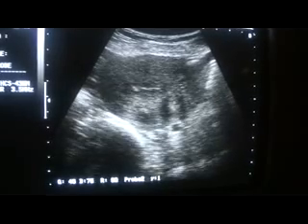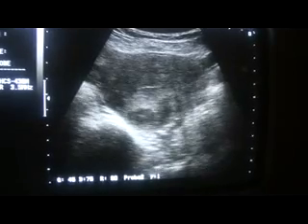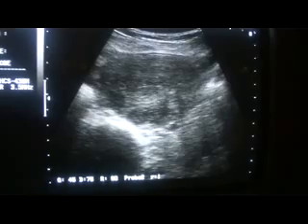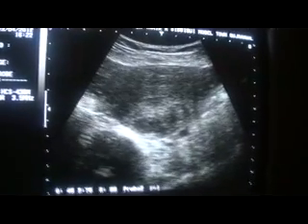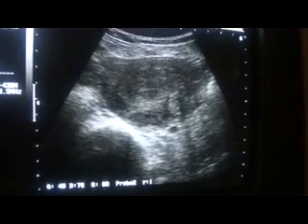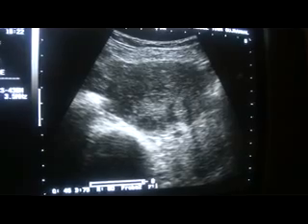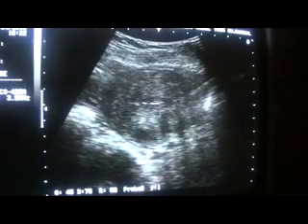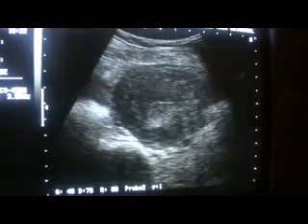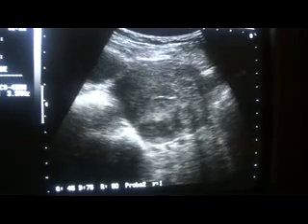Now this is the one that is encroaching upon the endometrial canal. This is measuring 23 into 15 millimeters, is echogenic in the center, hypoechoic at the periphery, is well demarcated, no posterior wall acoustic enhancement, no calcification, and this is the endometrial canal, this white line.